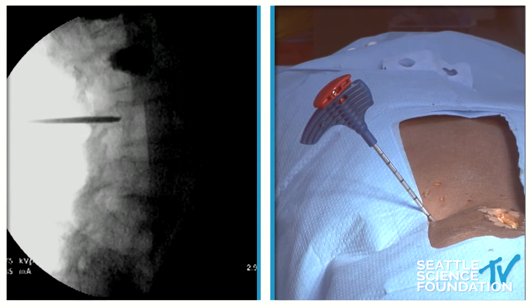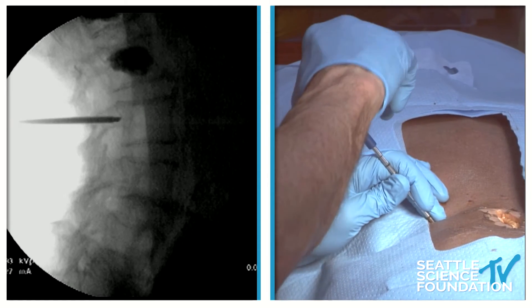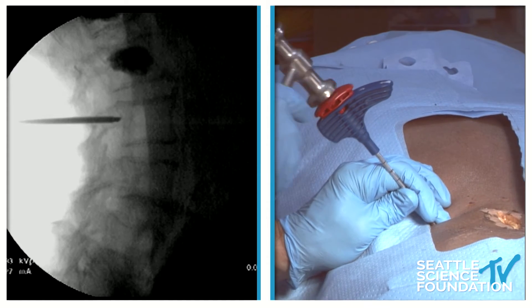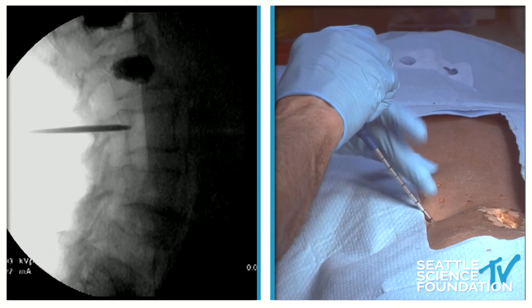If we're a few millimeters short, we'll go back around — and now we're nailing that posterior portion. I'm going to go ahead and turn the bevel the other way; we showed that technique previously. And we're in the posterior portion of the vertebral body.